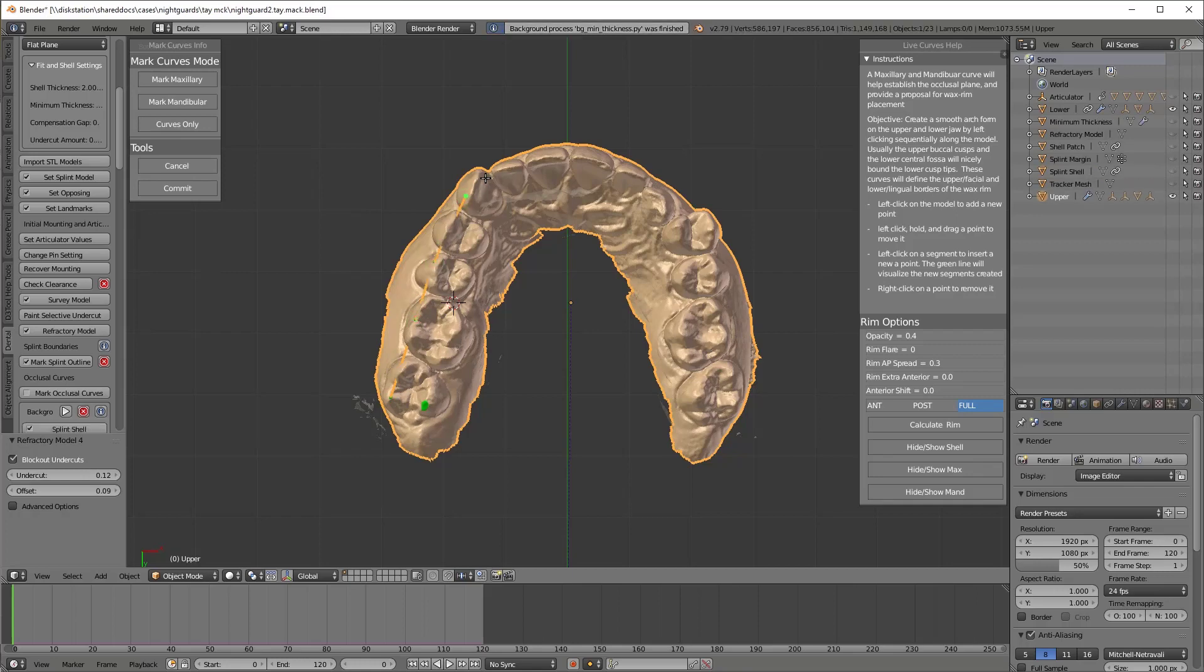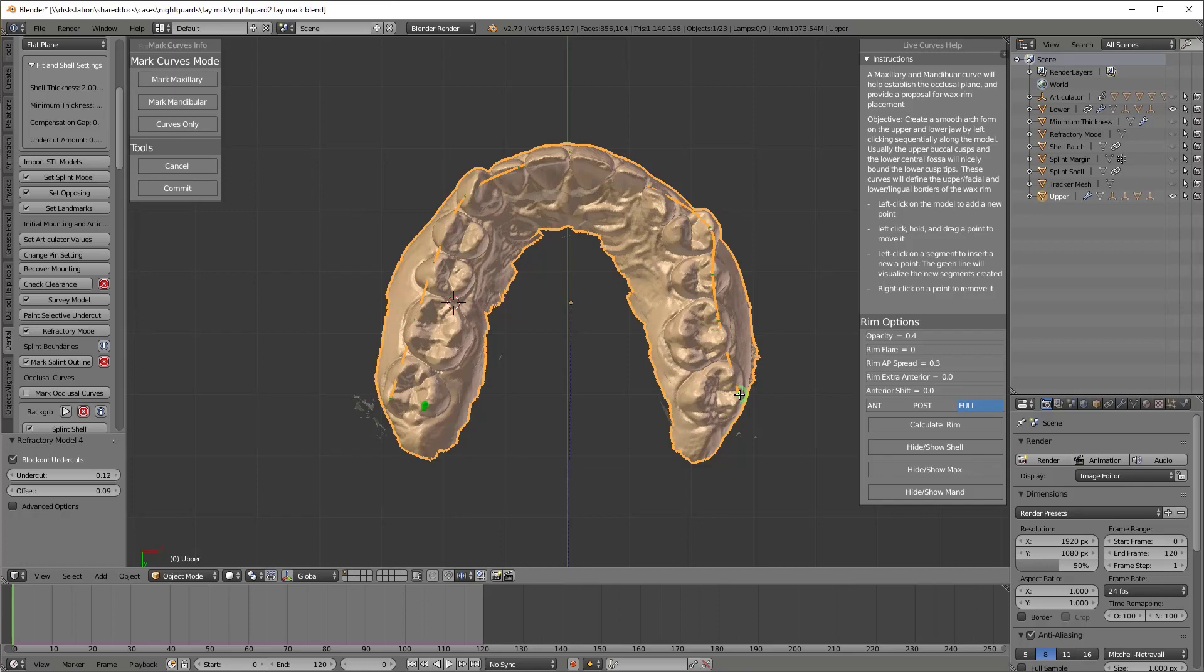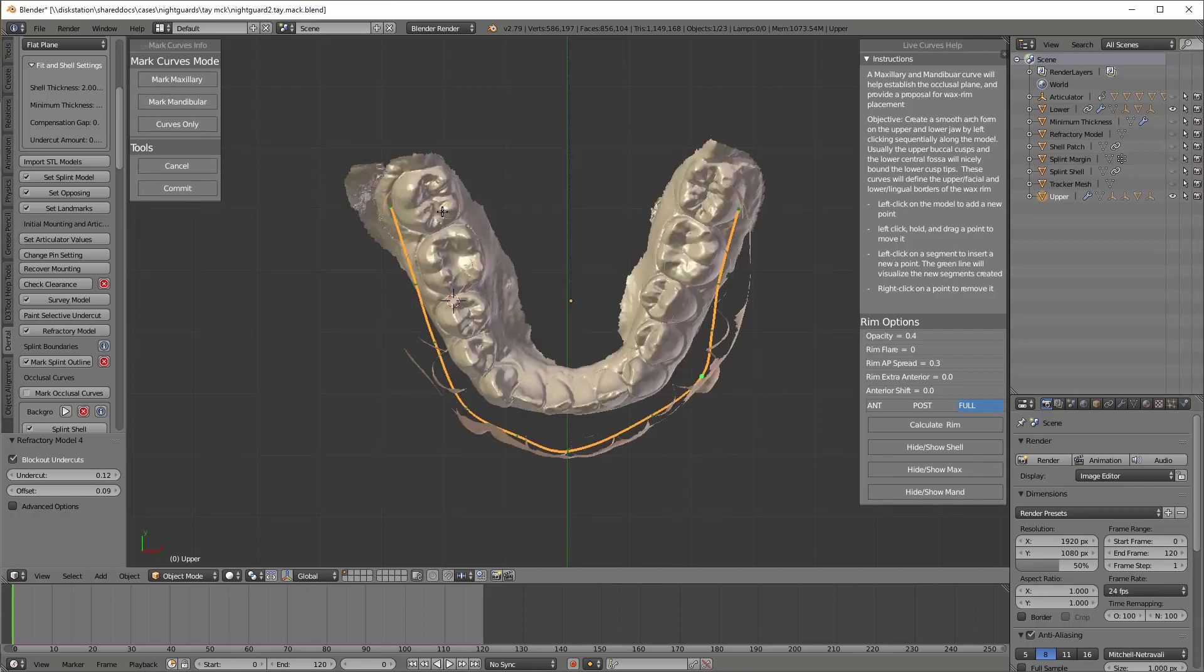The maxillary curves is the next step and the most important and most distinctive step of D3 splint compared to literally everything else I've used. No other night guard program attempts to actually make a flat plane on your flat plane splint. And this is how D3 splint does it. We're defining the lateral boundary with the maxillary curve.